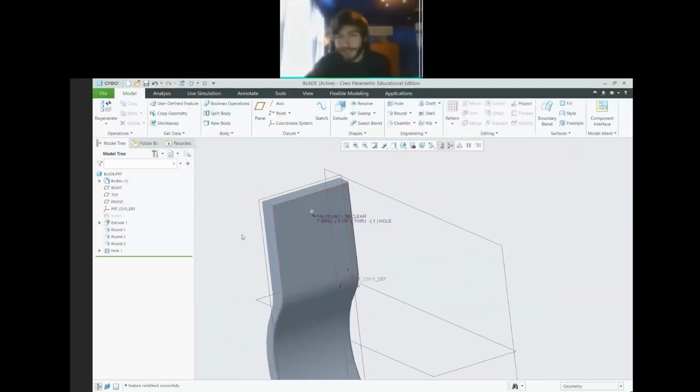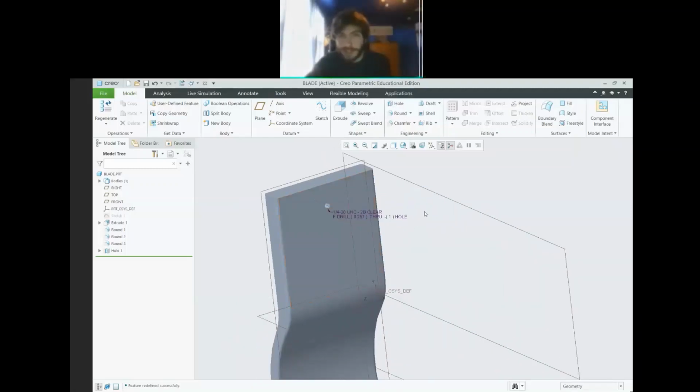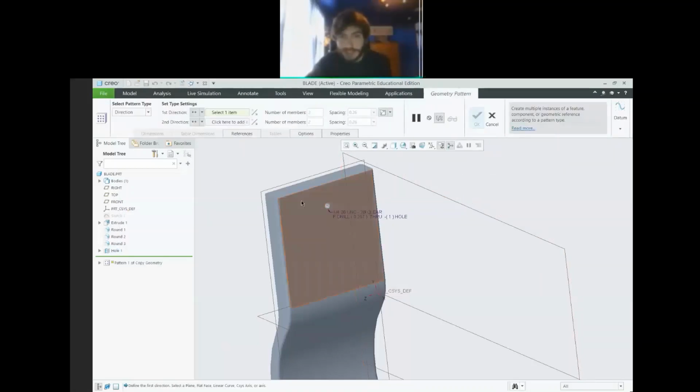The next thing we're going to do is, maybe it's not strictly necessary, but it's a nice feature to show off. So we're going to go ahead and select this hole on the left on our model tree. And when you do, you'll notice that this pattern lights up, right? So when I unselect it, it's not there, but now I have the purple. So we're going to select the drop-down, geometric pattern. And so this allows us to basically create a pattern of our feature, right?